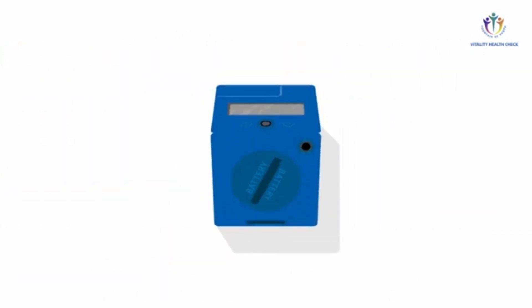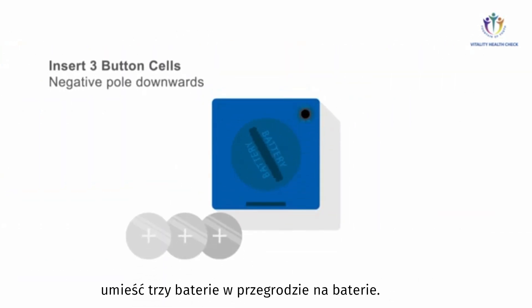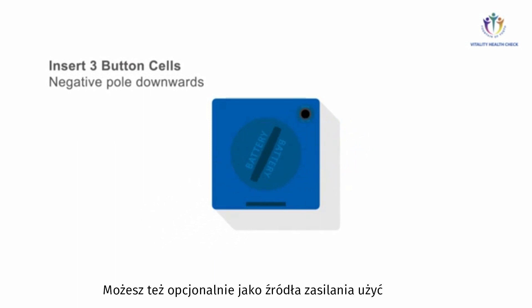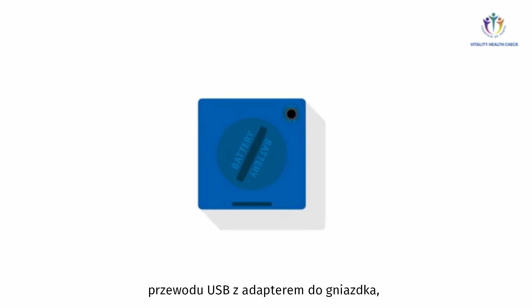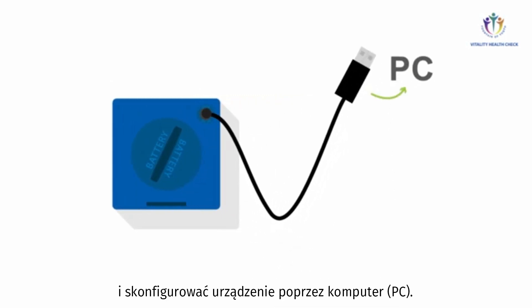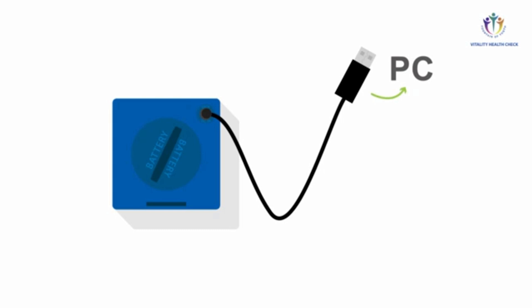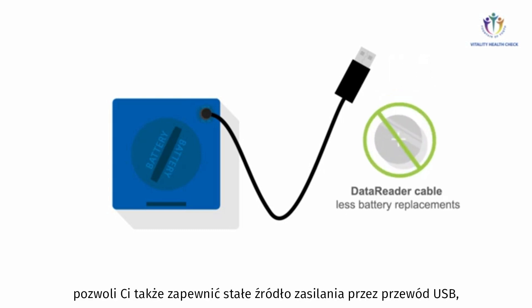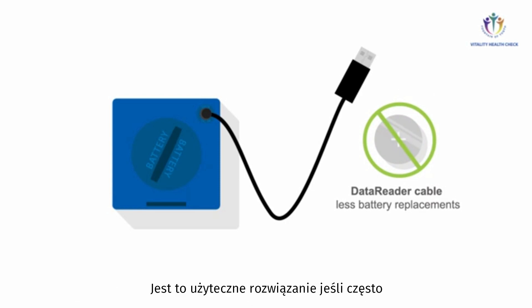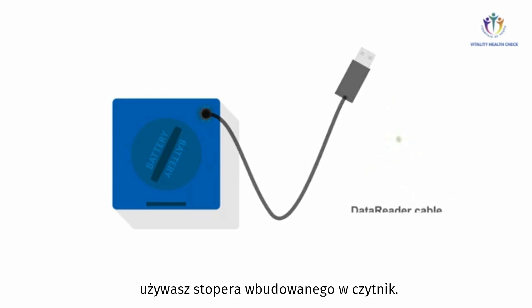For the first start of the VHC Reader, please place the three button cells provided into the meter. You may also use the VHC Reader with the optional Data Reader USB adapter cable to store or access data, and to configure the device via a PC. The Data Reader cable also allows you to ensure permanent power supply via USB, limiting the frequency of battery replacements. This is quite useful if you use the built-in timer of the VHC Reader frequently.